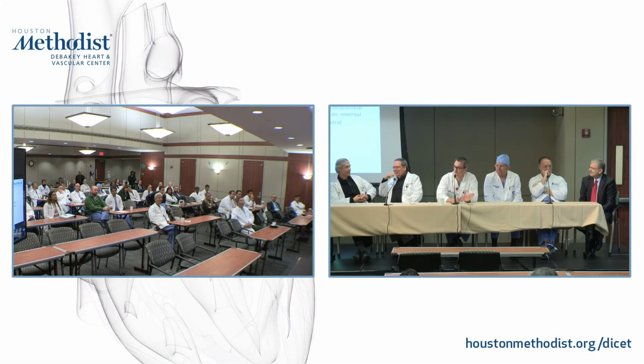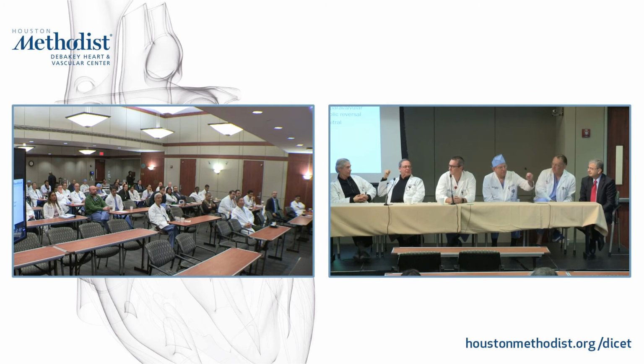And this 91-year-old did not have a pacemaker, but will probably 20% get a pacemaker during the TAVI and 20% have a pacemaker before the TAVI. There was a pacemaker? He had a pre-procedural pacemaker. Oh, well, even better then, okay.